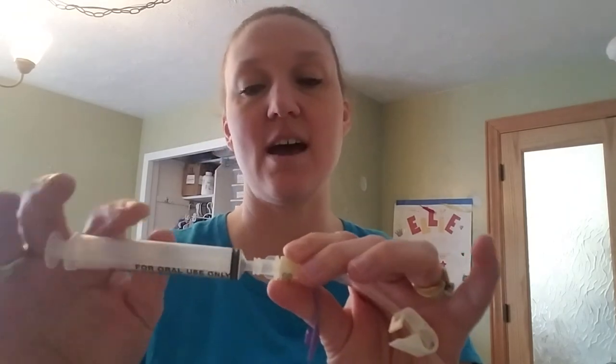Then you can give your medications right through that, so you don't have to have a million of the new ENFit syringes that insurance isn't paying for and pharmacies can't get, et cetera. But I did get this from my DME, so hopefully you should be able to get those through your insurance, and then you can just continue to get your oral syringes from your pharmacy.